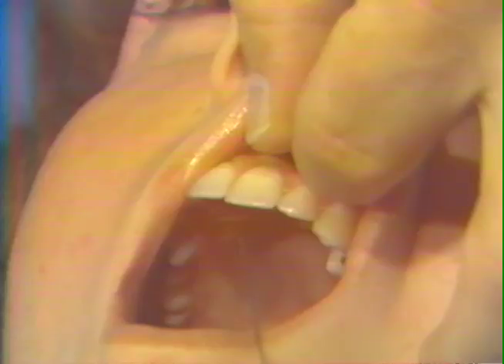For the injection of the upper left greater palatine nerve, open real wide, let me pull your cheek, don't let me turn your head. The approach is made from the opposite side to the area of the greater palatine foramen in this manner. For the injection of the long sphenopalatine nerve, the lingual approach, proceed in this manner. Open your mouth, let me pull your cheek and lip up here, relax your cheek and lip, open real wide. It is necessary that the patient maintain a very wide opening for the approach in this direction to the papilla behind the upper central incisors.